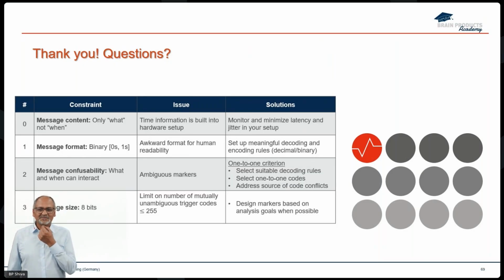I share your explanation. So parallel port is the way to go, because timing-wise, it's the most accurate one. And serial port, from my experience, depends on the operating system and how the hardware piece is communicating with the main board, etc. So you have a few layers in there, and you should make sure with several tools that the timing is accurate.